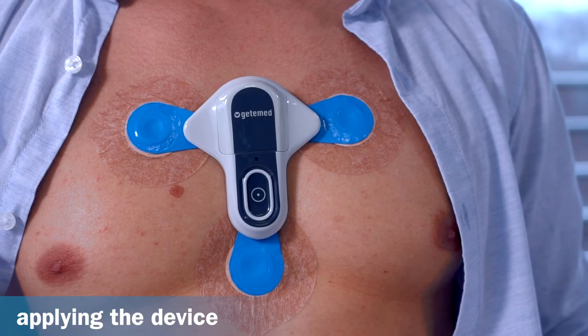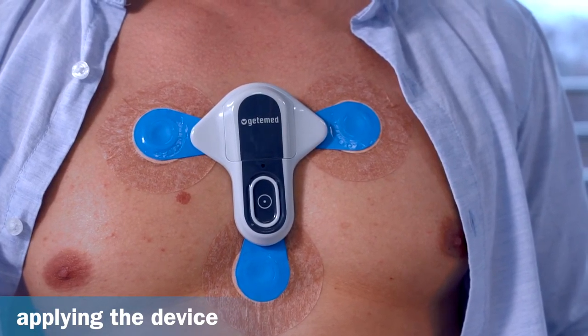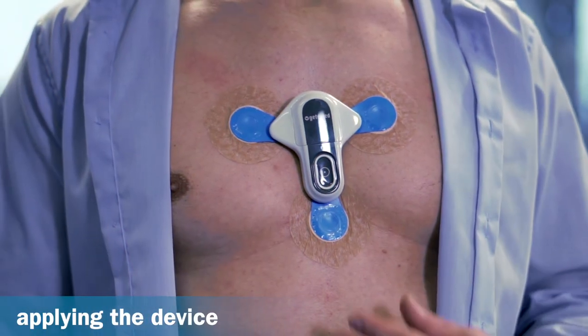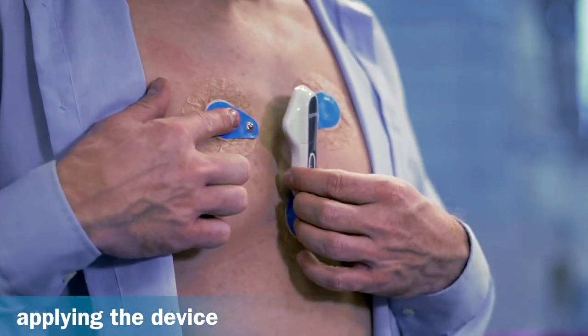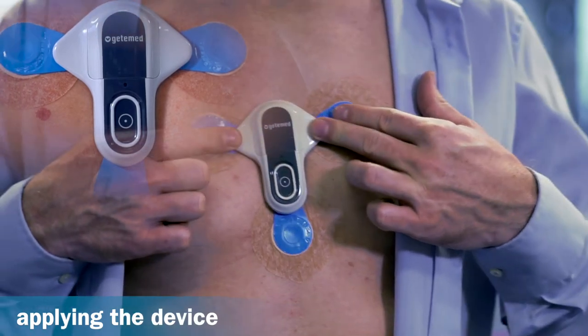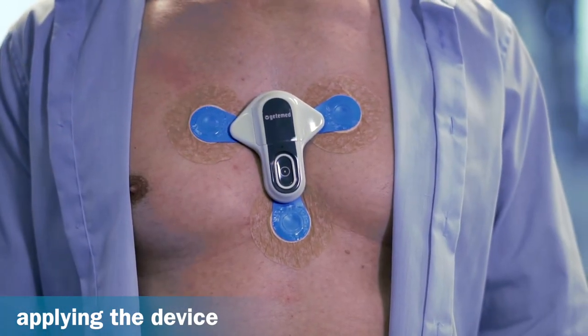A beep sounds, and the light indicator cycles through all its colours. Once the heart rhythm is detected by the recorder, the light indicator flashes green every five seconds. The recorder is now ready for use. If the signal quality is poor and the recorder detects that an electrode has become loose, the light indicator flashes orange. In this case, the recorder is not ready for operation.